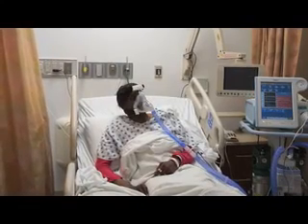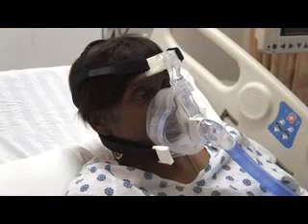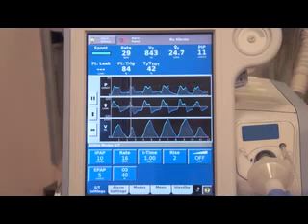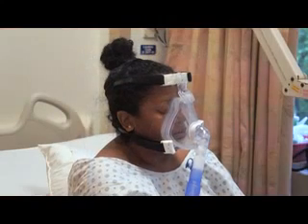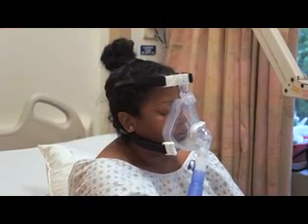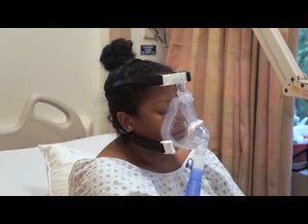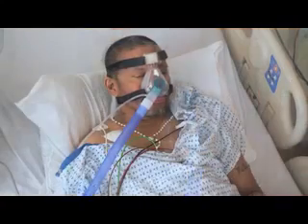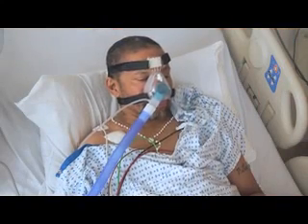Non-invasive positive pressure ventilation, or NPPV, can be used to manage both acute and chronic respiratory failure. In certain patient populations, NPPV offers the benefits of mechanical ventilation without the risks associated with intubation. All healthcare providers prescribing this therapy must be familiar with patient selection criteria, available equipment, and appropriate ventilator settings. This video will review these issues with a focus on acute respiratory failure.